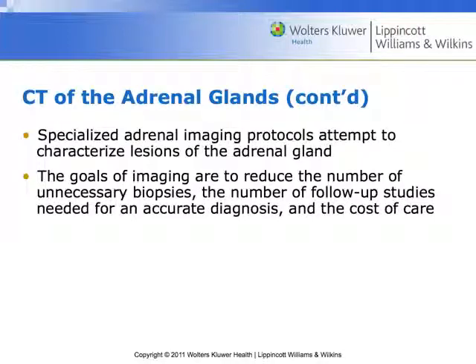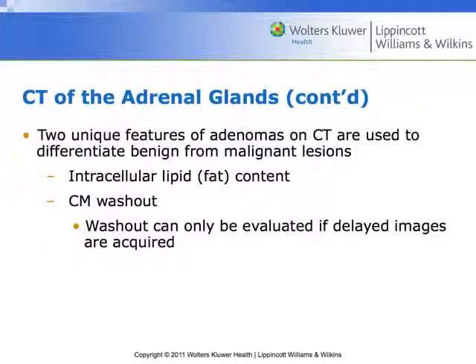So there are some specialized adrenal imaging protocols, and they're going to attempt to further characterize the adrenal gland. And the goal of imaging is to reduce the number of unnecessary biopsies, the number of follow-up studies needed for accurate diagnosis, and basically cost efficacy of care. So, the two unique features of adenomas on CT used to differentiate benign from malignant lesions are intracellular lipid, fat content, and contrast media washout. And again, washout can only be evaluated on delayed images.